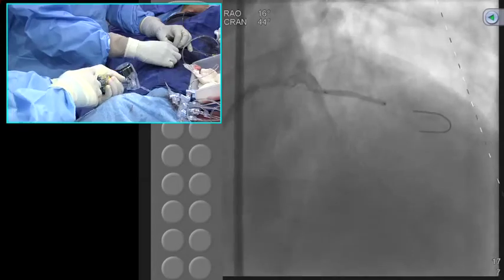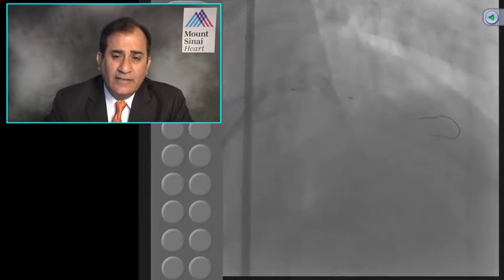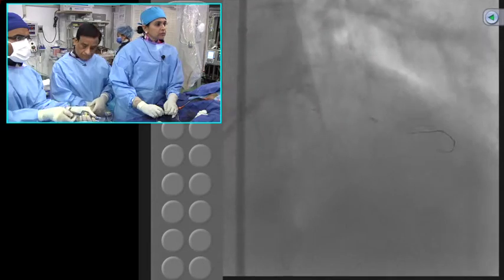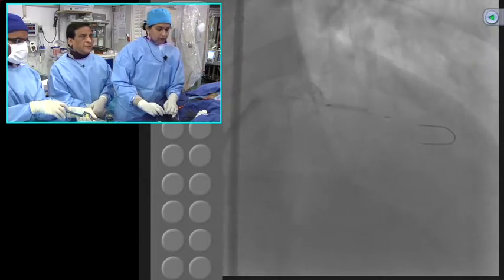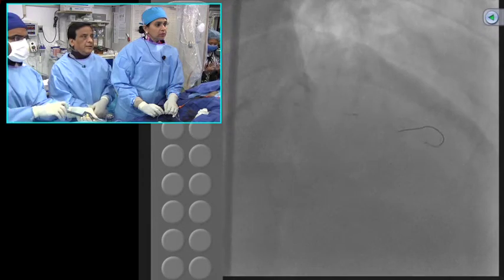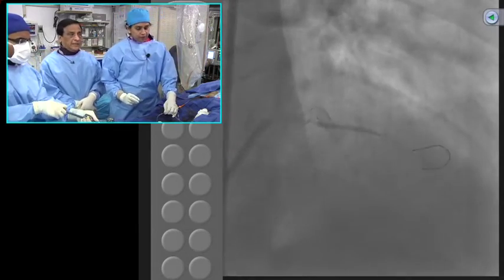But going away from the vein graft, for a native coronary artery, about 4 layers I have seen many times. So at what stage does surgery come back into play? Many of these cases already have a surgery. But you are right, after the third layer of stent, if the patient has come back requiring a third layer of stent, I think we should think about sending that patient for surgery.